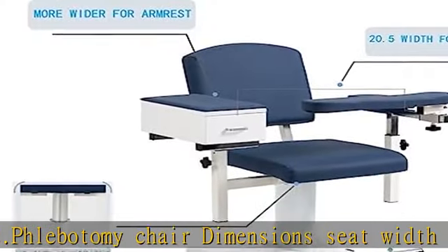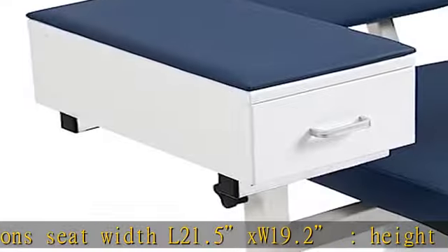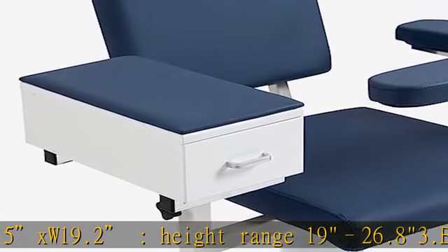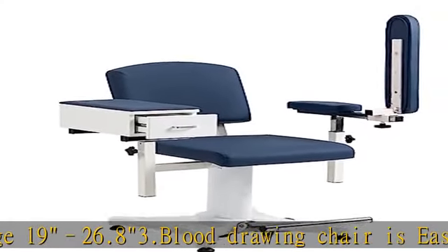4. Blood Chair can load 500 pounds weight capacity. 5. Standard 5-year warranty. 6. Easily removable work surfaces, 1 drawer available. See the description to get this product today at the best price.